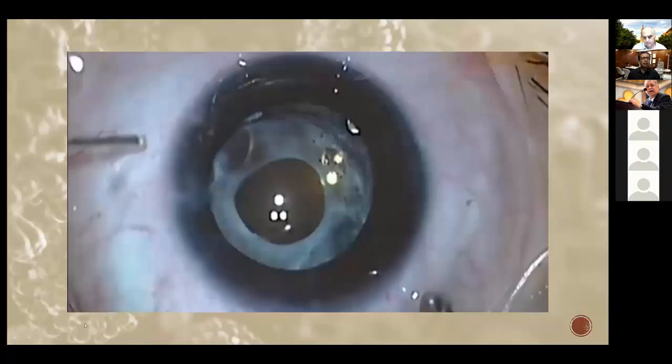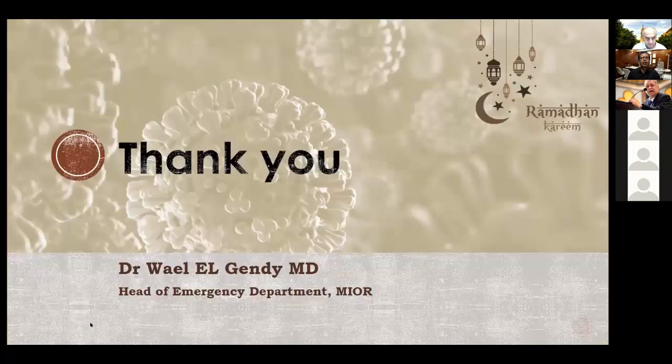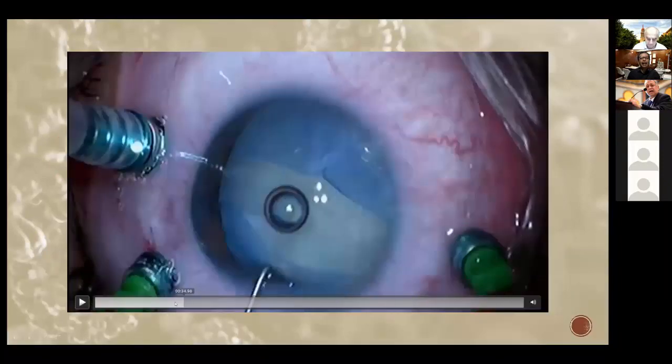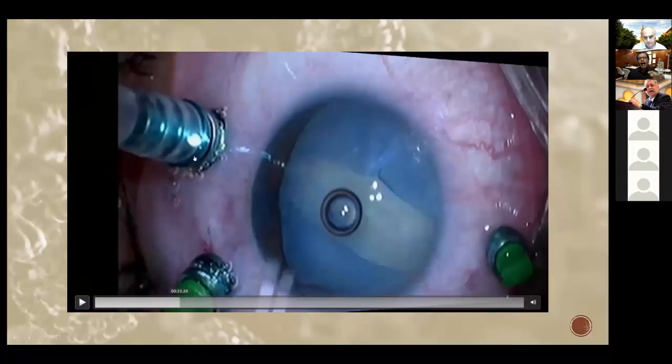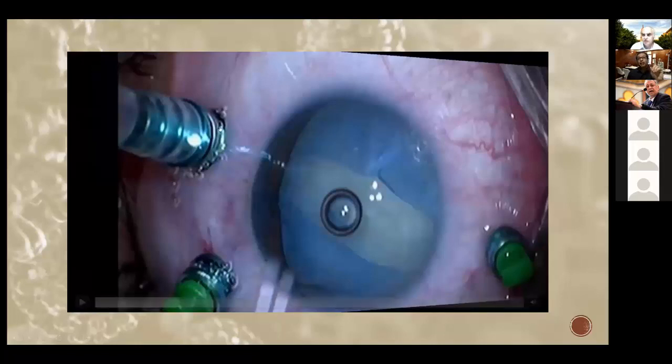I want to stop here. Sorry. I want to stop at this point and elaborate why this happened to me. I have my trocars inside. The globe is soft. The infusion, Dr. Wael? Sorry? No, it was not on. Infusion on? Yeah, the irrigation port was not open.